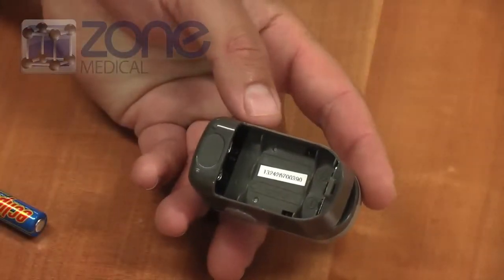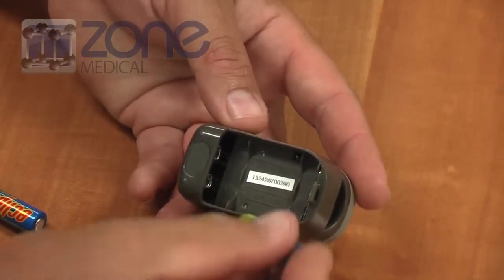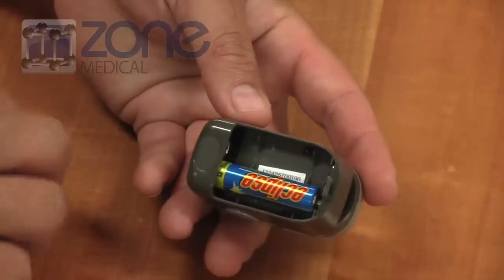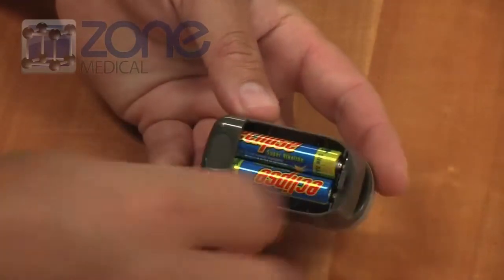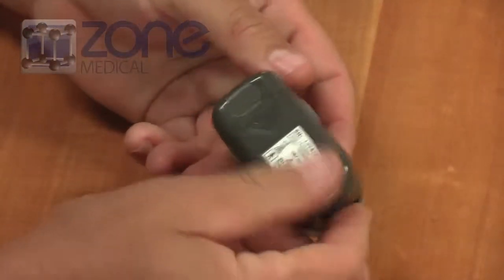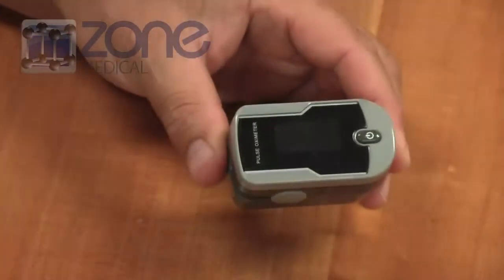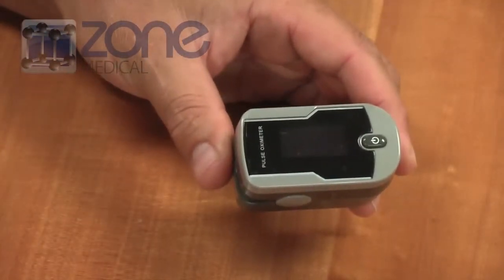The C21 adult finger pulse oximeter is supplied with two AAA batteries. They are easily inserted into the back of the unit. It's a very sturdy battery case, so you don't find that these will break in normal everyday use. You'll get about 30 hours of continuous use out of one set of AAA batteries.